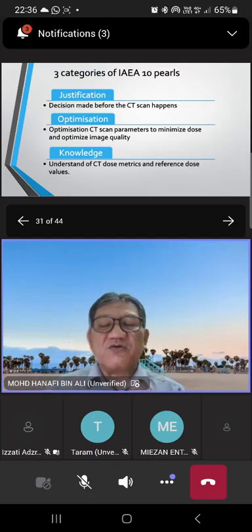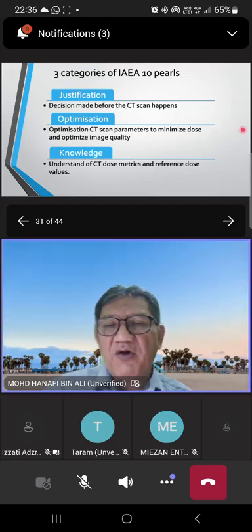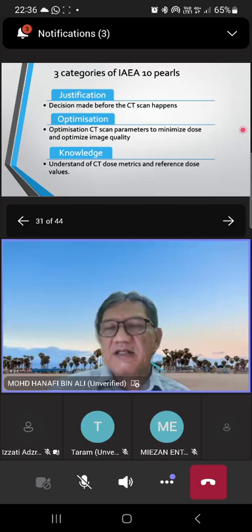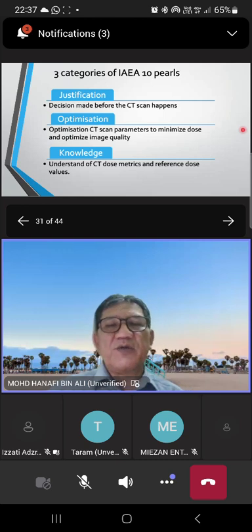Tapi kita mesti guna glove dan juga protector kita, lead gown. Kita mesti tutup dia dan dia ada half life. You guna isotop apa, for example, then half life dia berapa? It's still on until quite some time because exponent, the radiation from isotope still there. So we have to be very careful and handle that in proper way.